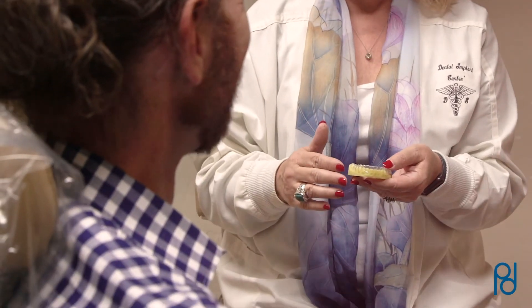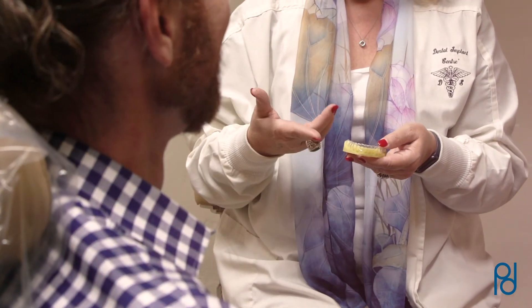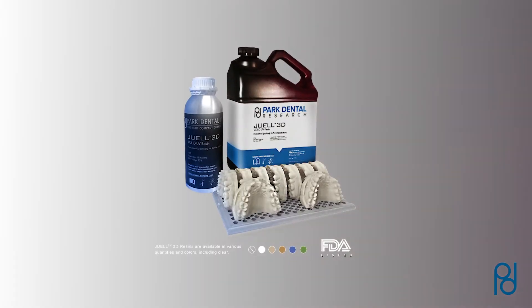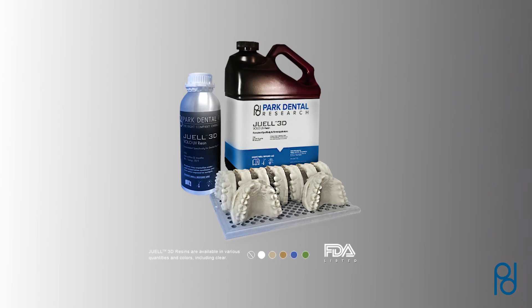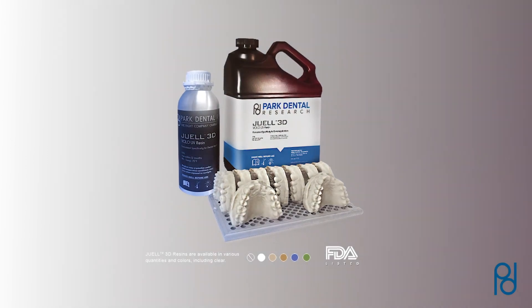It's the emerging standard for dental professionals looking for the latest technology in digital dentistry. We offer an affordable range of JUELL 3D UV resins designed, developed, and tested for market-leading digital dentistry.